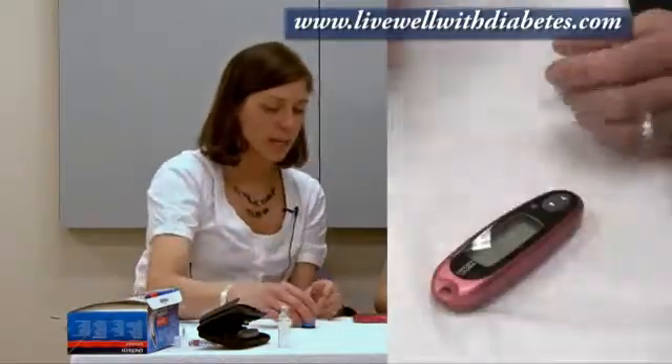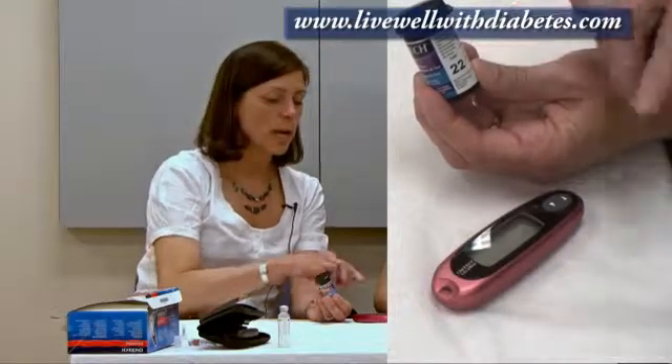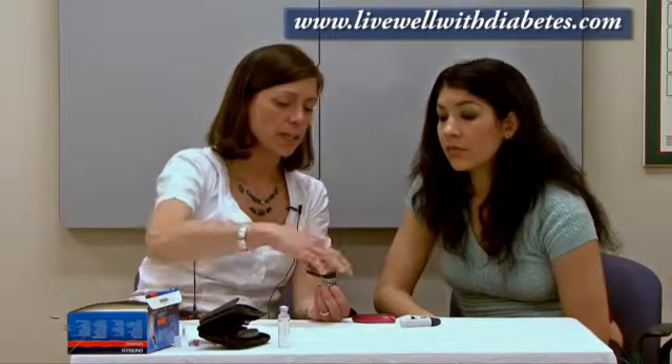Over here is the machine, and this is a bottle of test strips. Each bottle has what's called a code number on it — this one has code number 22. I want to make the machine match the number on this bottle. When they make up the test strips in a lab environment, the chemicals used change slightly from batch to batch. I liken that to different currencies: a Canadian dollar, an American dollar, an Australian dollar — the banker needs to know what kind of money you have to give you the right value. Similarly, to get the right value for your blood sugar result, you need to tell your machine which code number you're using. That's called coding, or calibrating.